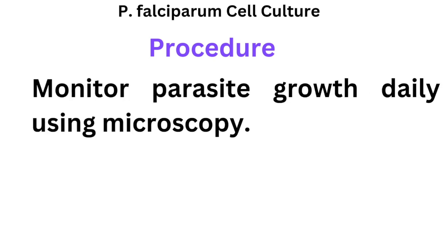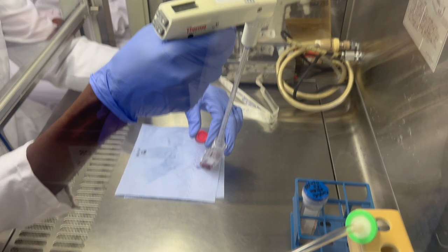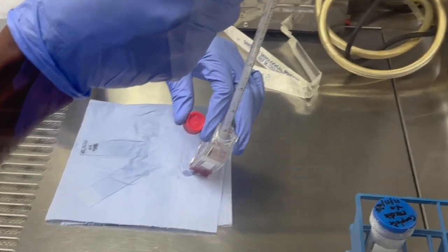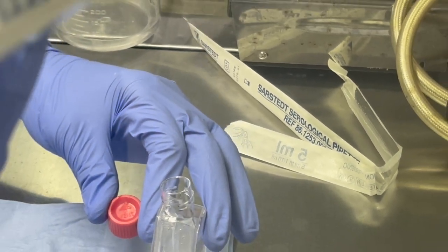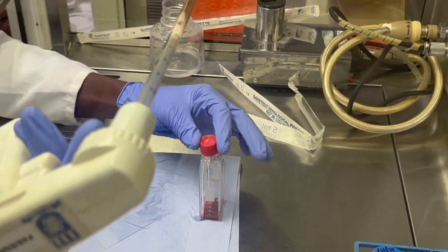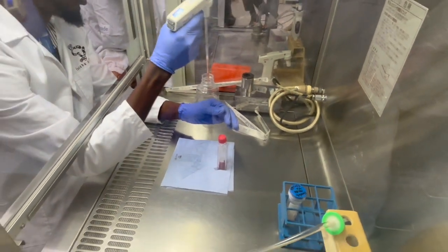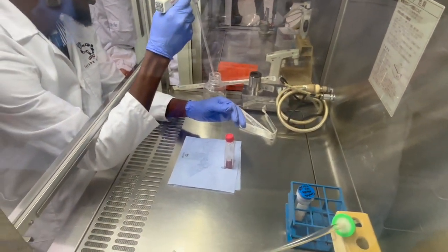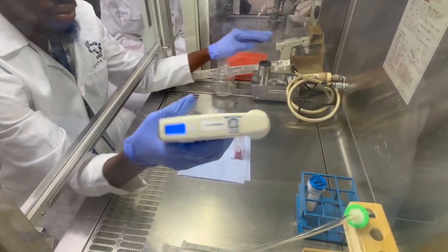With the parasites, you want to monitor their growth every 24 hours. To do this, carefully aspirate the media. Because this is a suspension cell line, the red blood cells are floating and will easily mix with the media if you're not careful. Handle them very gently, tilting carefully to remove only the media while leaving the parasites and red blood cells settled at the base.